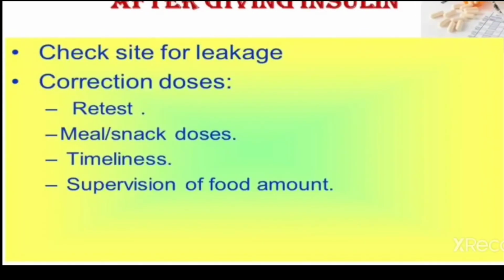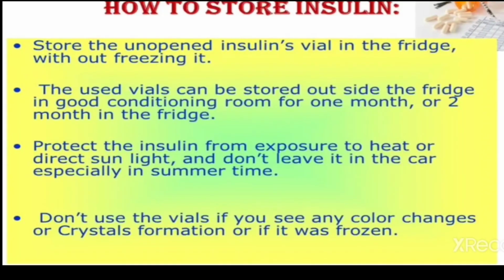After giving the insulin, check the site for leakage. The correction dose depends upon the retest, meal or snack doses, timeliness and supervision of food amount.